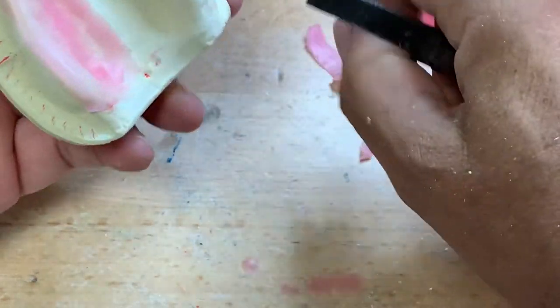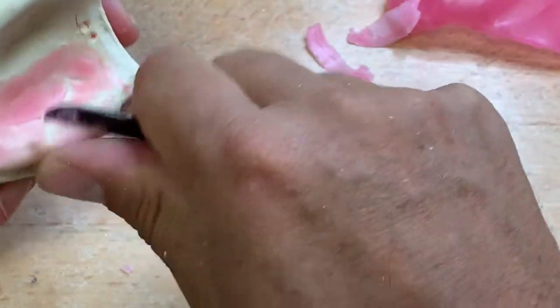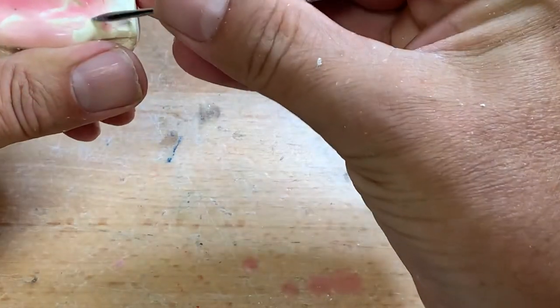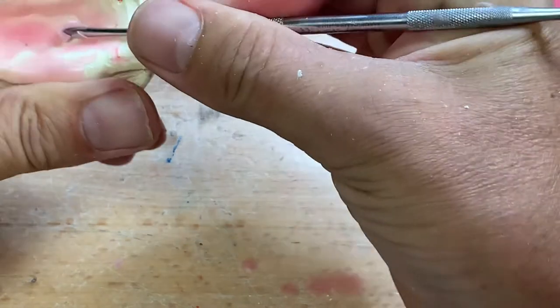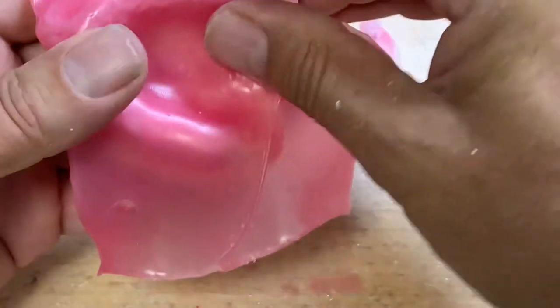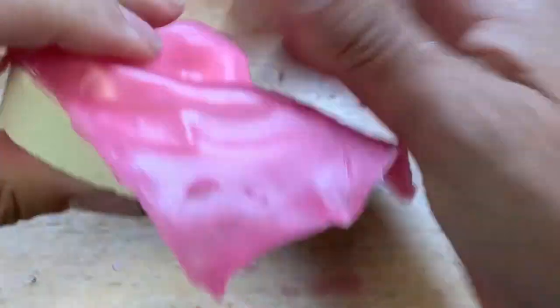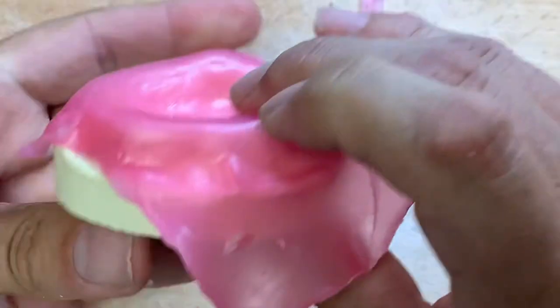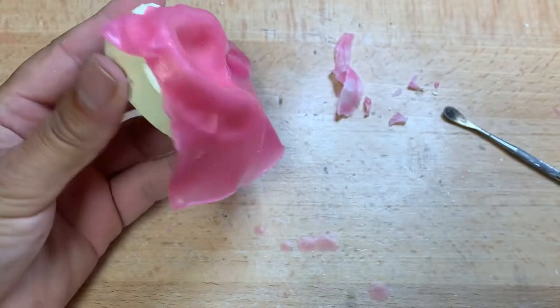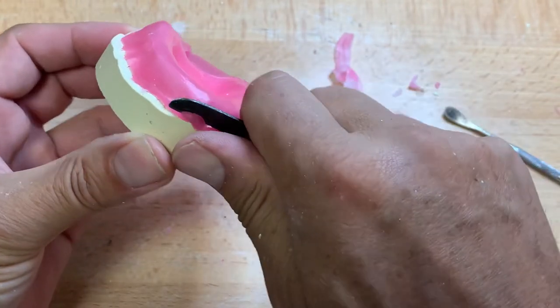Let's go back to the one sheet of wax all the way around. I would go all the way down into the sulcus, provided you have your line drawn on your model to aid and guide you in trimming the extent of the tray. You can use a variety of instruments here — your number seven, a Bard-Parker knife, or your plaster knife.